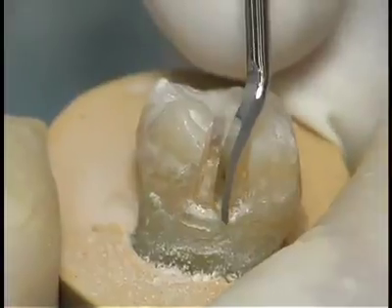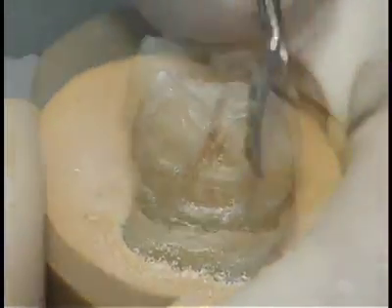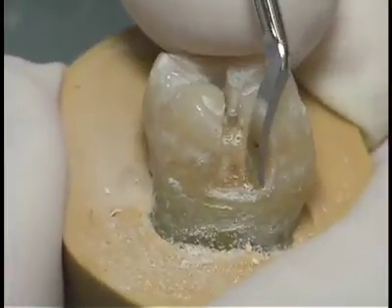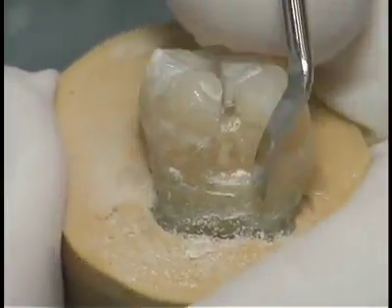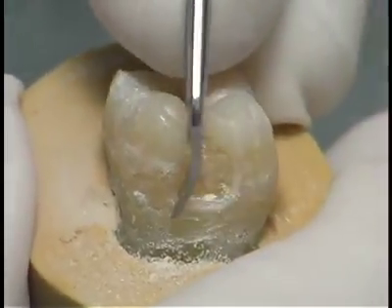Use a gingival margin trimmer for planing the gingival cavosurface margin. By planing, we develop a small bevel and all unsupported enamel is removed.